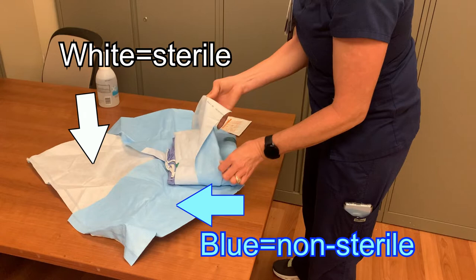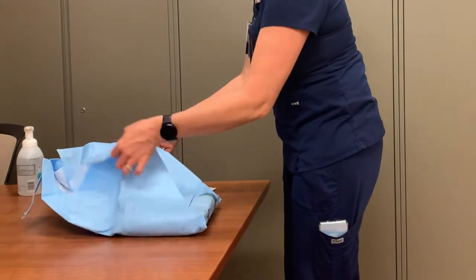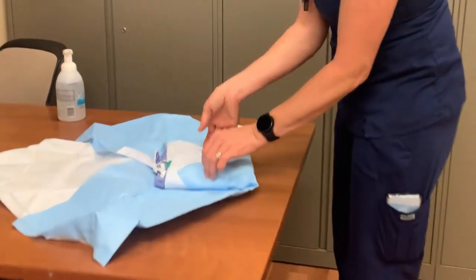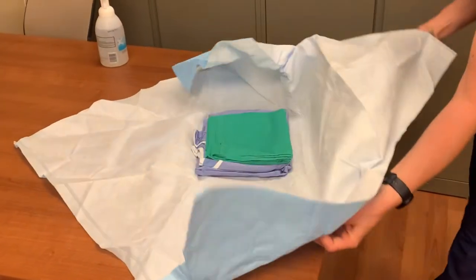Touching the white surface will contaminate your sterile field. The top flap of the package must be opened away from you. This will reveal the two side flaps that can be opened to their respective positions. Then open the final flap toward you. While opening, be careful only to touch the blue side of the sterile wrap.